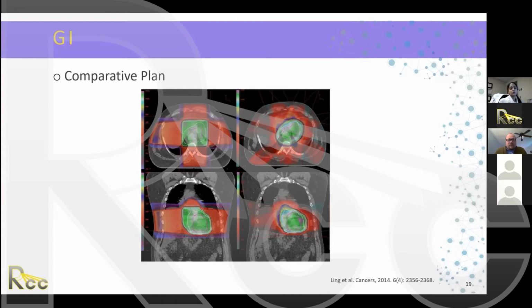So there's always a fear of potential neutron contamination, and so that's why we prefer to use 6 MV over a higher energy for these cases with IMRT and VMAT. Where I did my residency training at the University of Miami, the standard was we actually used 15 MV to treat all of our prostate cancer cases with VMAT, but that was just an institutional preference. But in general, in my practice, with IMRT, unless for some odd reason we're not able to get a good plan, or the hot spot is through the roof, we tend to stick with 6 MV. Great, thank you.